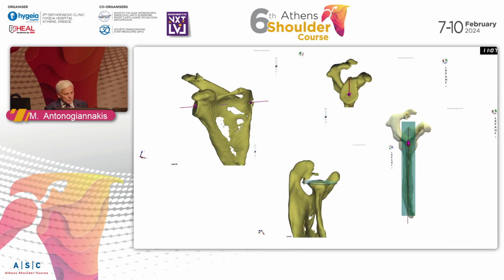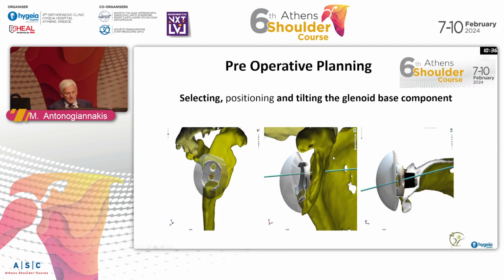which we have to be able to understand. When we say that this is the center of the glenoid, this is something that can be here, or can be here, or can be here. And if we say that this is the surface of the glenoid, this is the surface that covers most of the glenoid. But still, it can be 2, 3, 5 degrees different, and this means that what we calculate in numbers is not absolute. That's what we were realizing slowly.